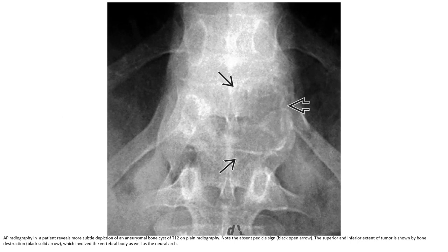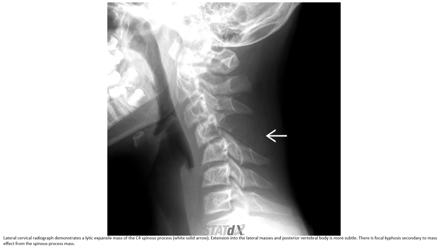An AP radiograph in a patient revealed a more subtle appearance of the aneurysmal bone cyst on plain radiograph. Note the absent cortical signs. The superior and inferior extent of the tumor is suggested by bone destruction, which involves the vertebral body as far as the neural arch. A lateral cervical radiograph demonstrates an elliptic expansile mass of the spinous process.